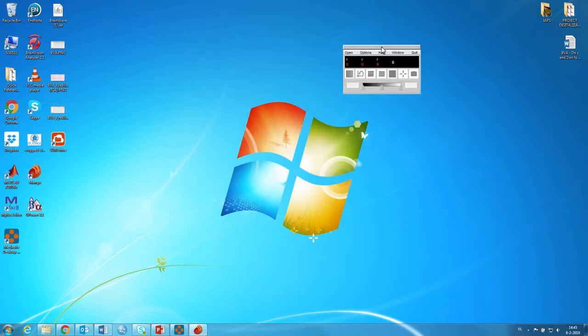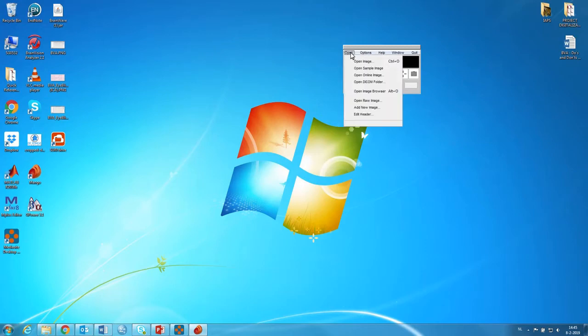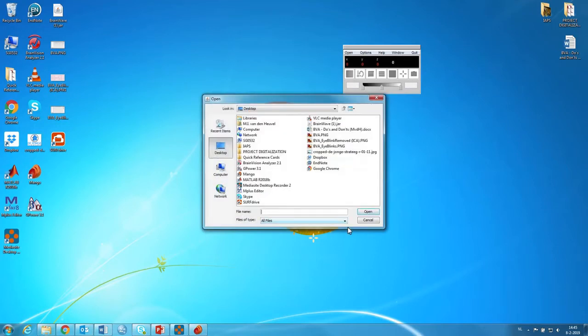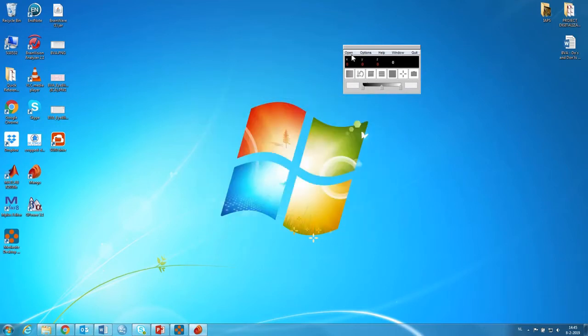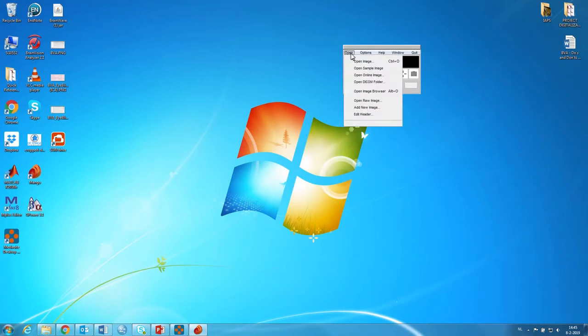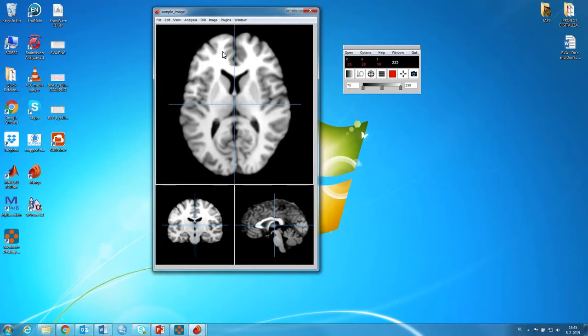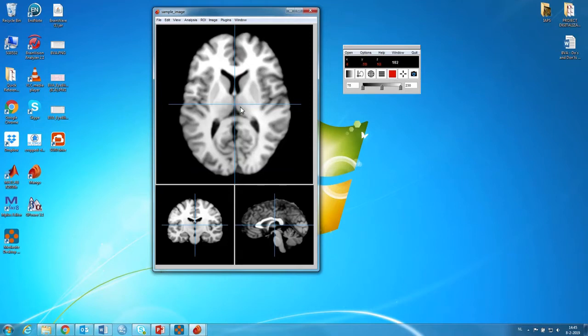And this is actually it. So this is what you get. And what you can do is you can open just some images. So here you can open a sample image. And this is one of the brain templates that you can just play around in, which is really nice. Especially if you're new to neuroanatomy and you want to just poke around in a real brain.